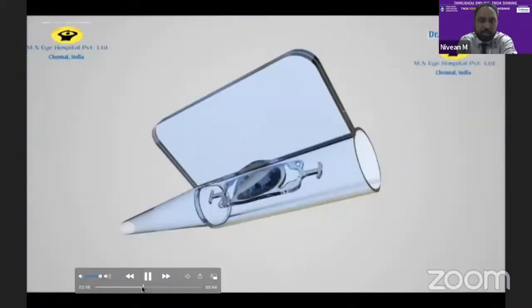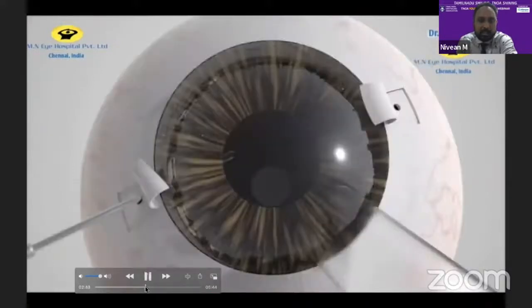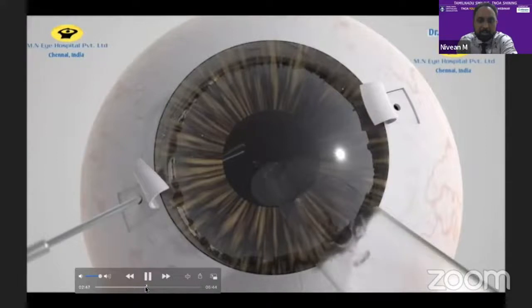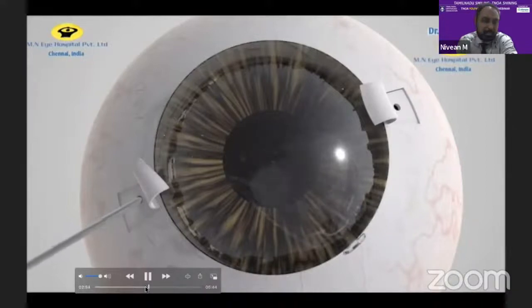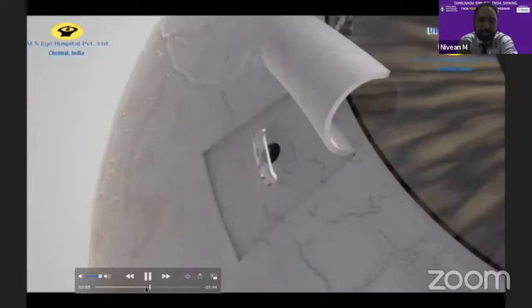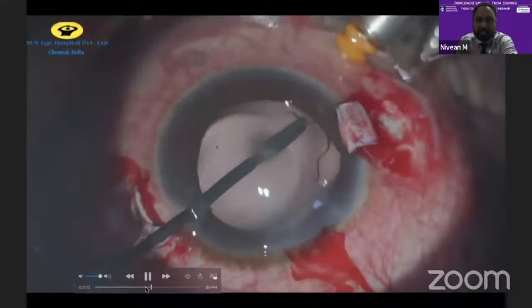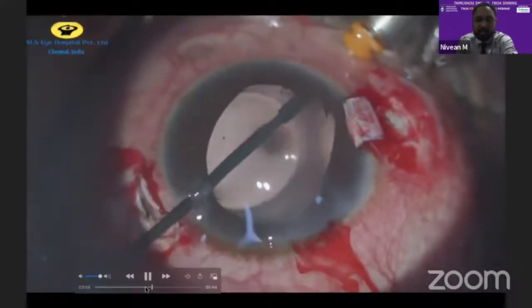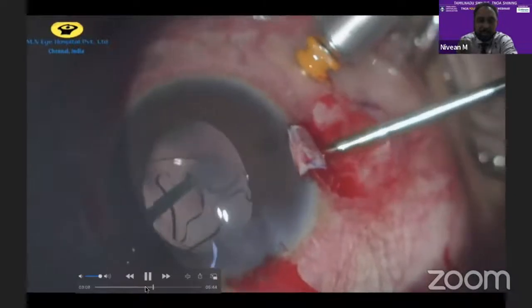So just to show you a normal animation clip. Loading is in any cartridge, and then as you slowly inject, you can see the T haptic coming out. Ideally, it will be in the head and the neck if you can catch both together. And that makes it easier when it actually comes out through the sclerostomy. And those T haptics stay in position and the flaps are closed. So moving on to the other side using the handshake technique, you grasp the arm of the IOL design and then transfer the other haptic, as you can see here.